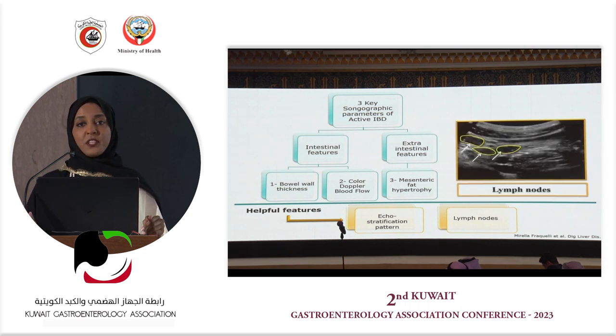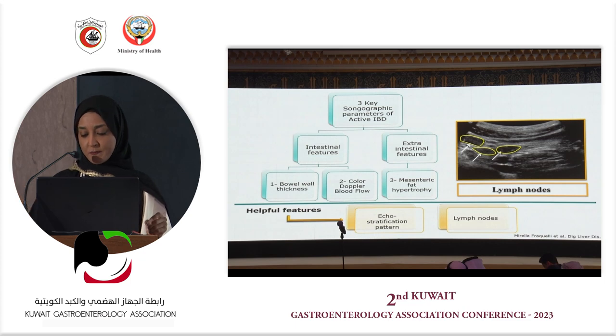Lymph nodes, I guess the pediatricians are interested in this because we can see them very frequently in kids, not in adults. We can't rely much on the lymph nodes because they're black and elliptical or oval in shape, but they're irreversible. So once you have an inflammation, even if you keep the patient on medication, the size of the lymph node won't regress.